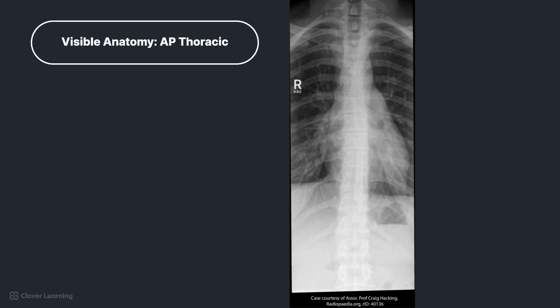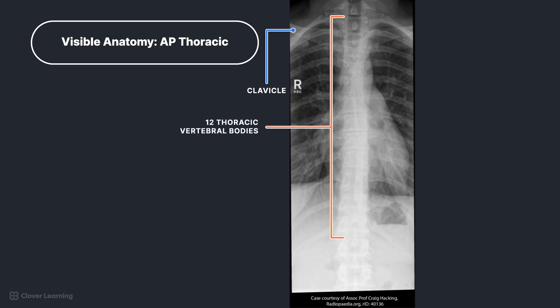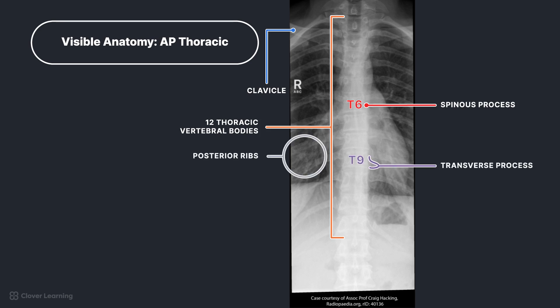Can you identify the anatomy? Working from superior to inferior, we can see the clavicles, first ribs, which articulate with T1 shown here, the remaining thoracic vertebral bodies of T2 through T12, spinous processes — this is T6 — posterior ribs, and transverse processes. This is T9.